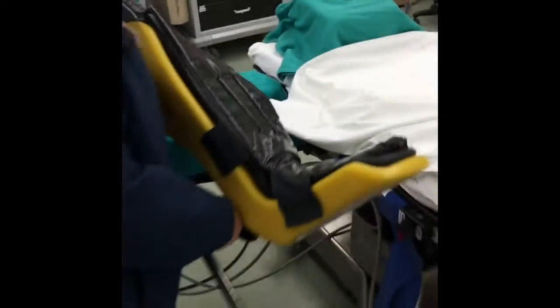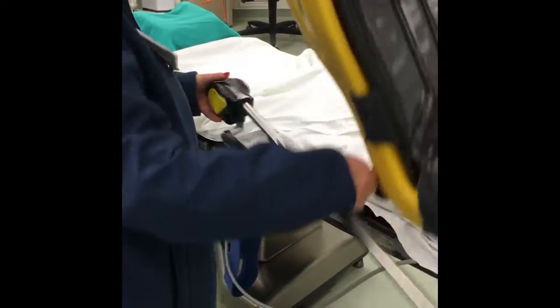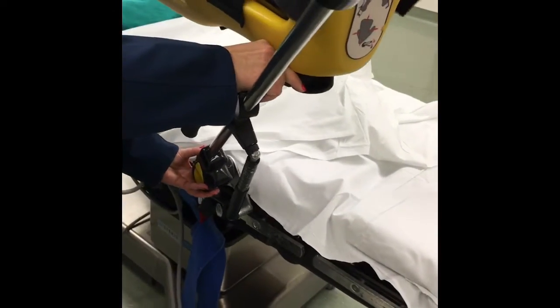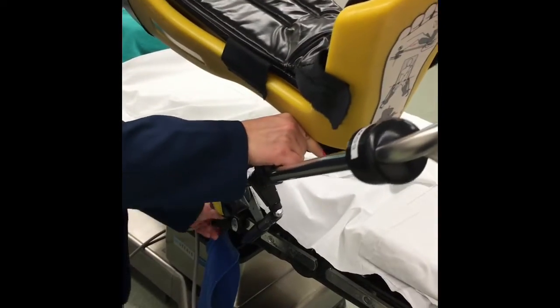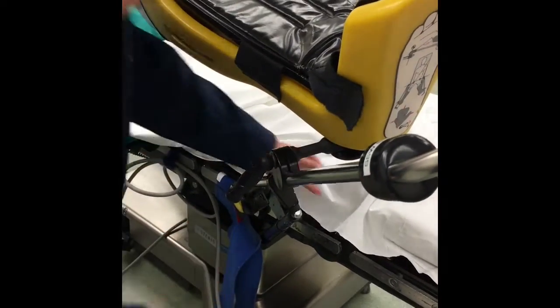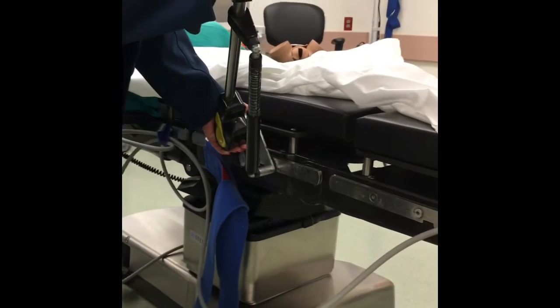Then you hold your stirrup in two spots to make it easier for you to hold and move it. One hand here and one hand here. And you're gonna put it into this attachment. And it won't go all the way down right now, so you have to unscrew, and it dropped all the way down.